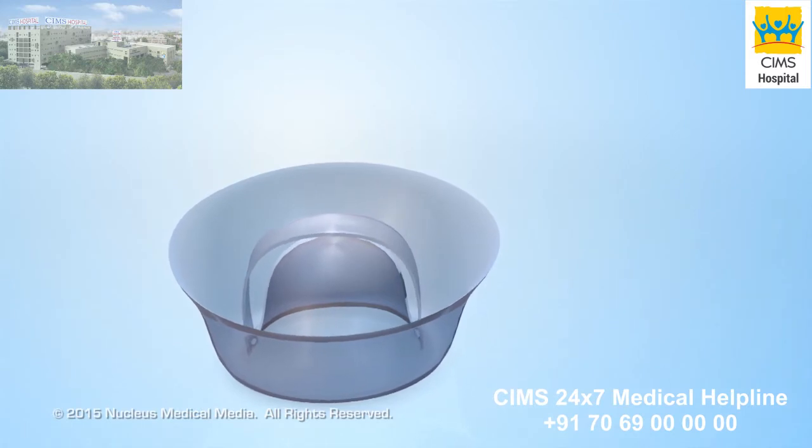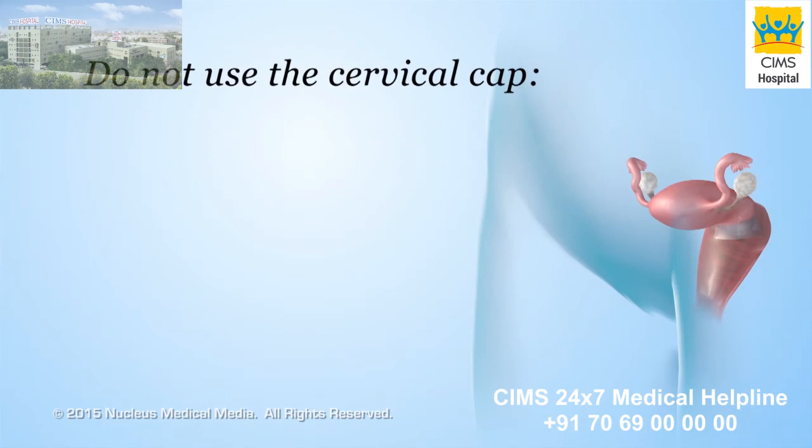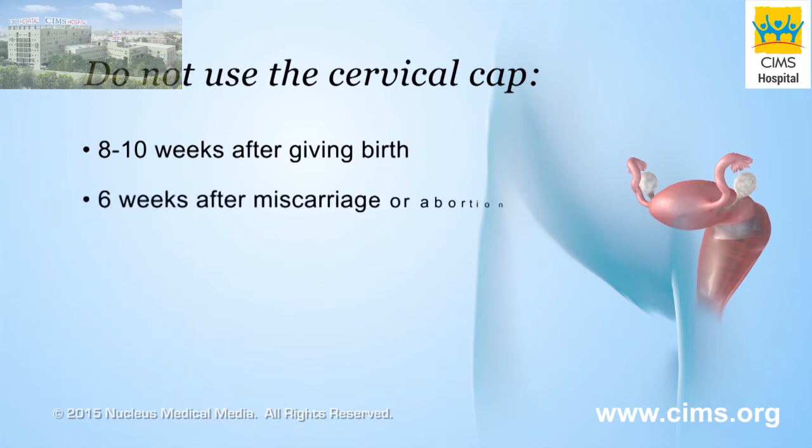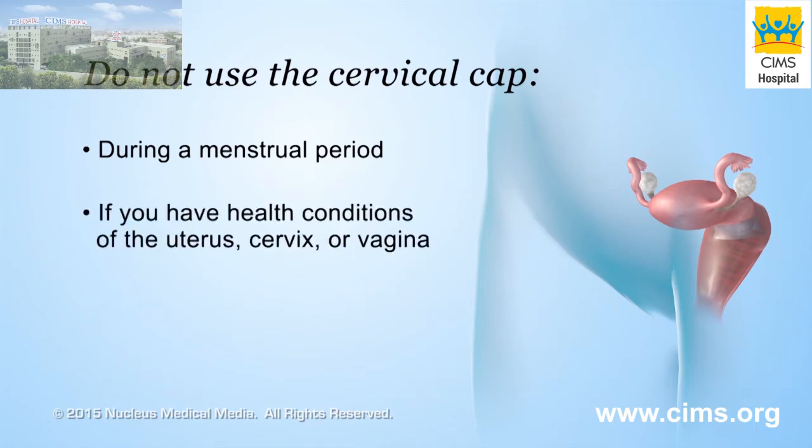There are a few things to remember before using a cervical cap. Do not use the cervical cap if you have given birth within 8 to 10 weeks, or had a miscarriage or abortion within 6 weeks. It is easier to become pregnant using a cervical cap during these times because the cervix is larger. Do not use a cervical cap during the menstrual period because it can block normal drainage of blood from the uterus. Also avoid use if you have an infection or other health condition affecting your uterus, cervix, or vagina, or if the cap is torn or damaged.